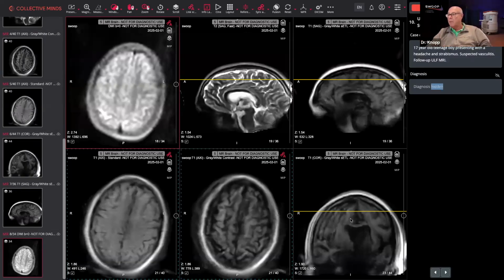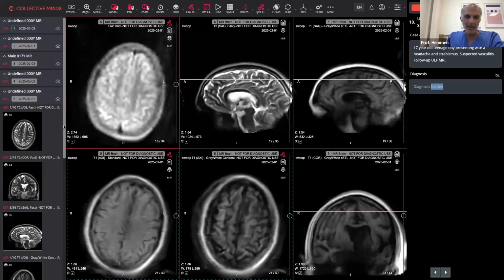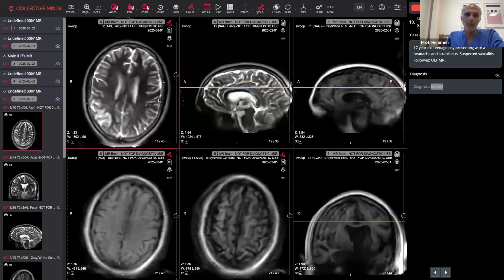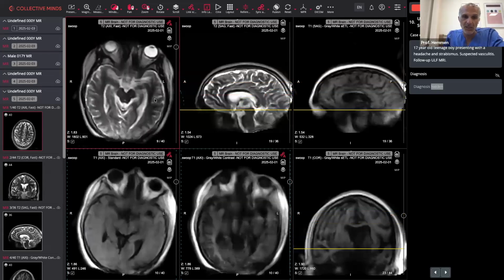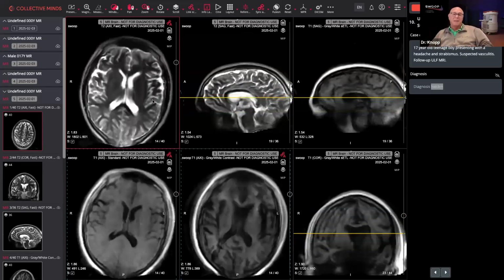This might be due to his body habitus, since he's somewhat large. Yeah, exactly. I tried to put him into the machine, and Steve has just said it's 242 pounds. Wow, that's big. I had some problems getting him in. And also because he was not feeling well and was having so much headache, it was hard to tell him to rest for some minutes, because he wanted to get out quite quickly. It's sometimes much easier to handle babies. At least you can handle them easily.